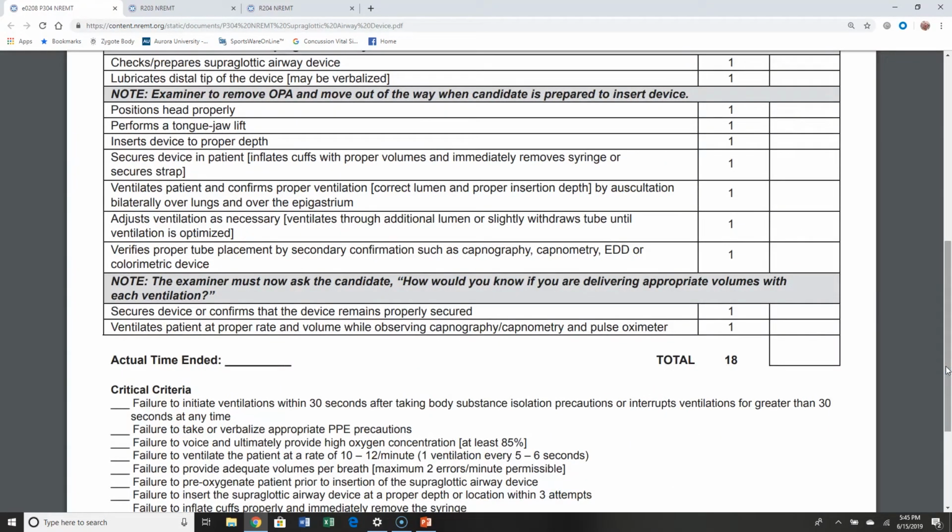You adjust your tubes if you need to, if you're using a dual-lumen system. We also ensure that the tube stays stable in the patient, and this can include taping the tube in place, or using a type of device. It's usually called a Thomas device. It's a kind of plastic mount, like a mouthpiece almost.